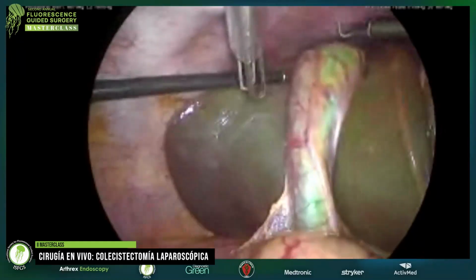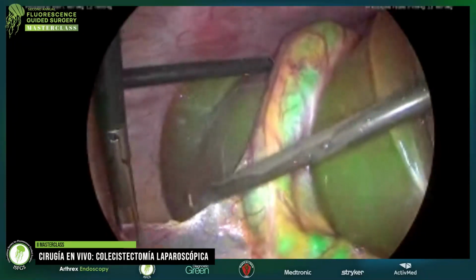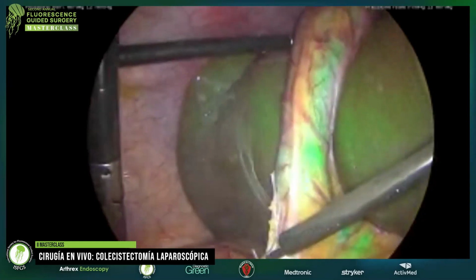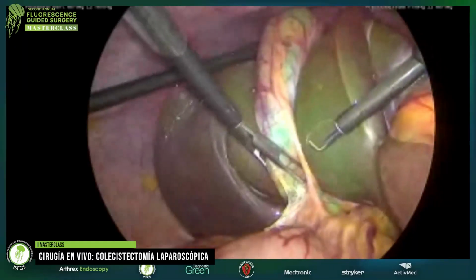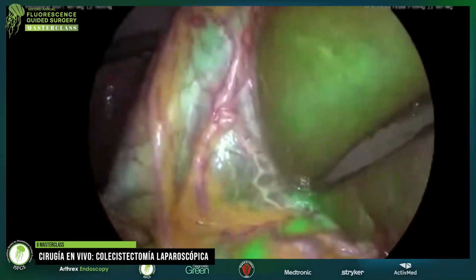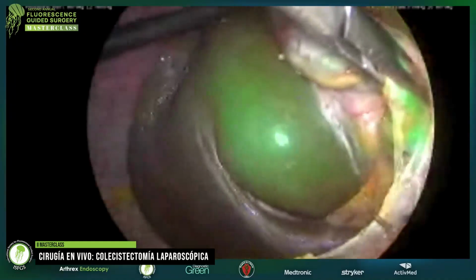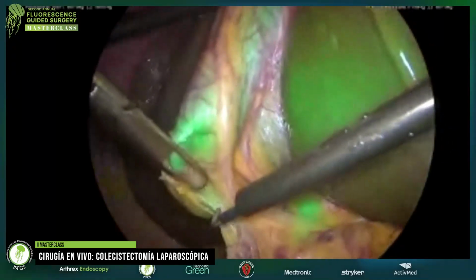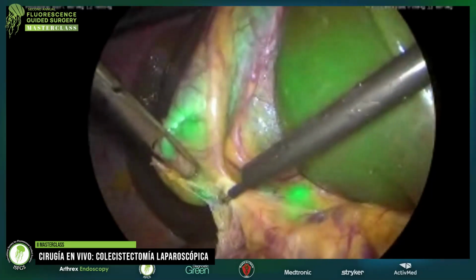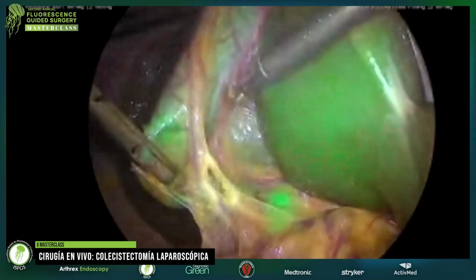Push, thank you. We have a little bit of distension of the stomach. I'm sorry for this. So you can see that we can clearly see the ICG inside the gallbladder. And now we'll try to identify the common bile duct. It's here. Okay. And I think we have just here what we suppose for now to be the cystic duct. So I'm going to start to release the anterior peritoneum. You can see that the great majority of the ICG is inside the extrahepatic biliary ducts.